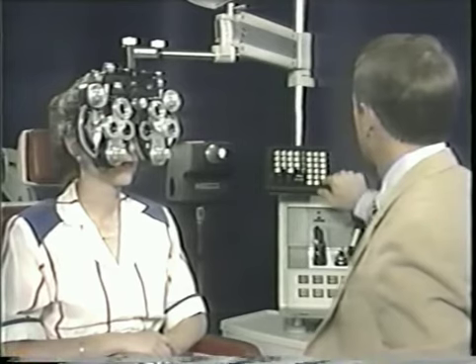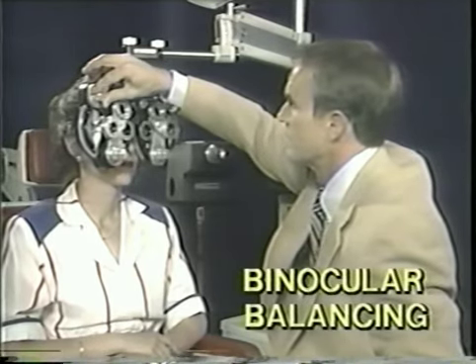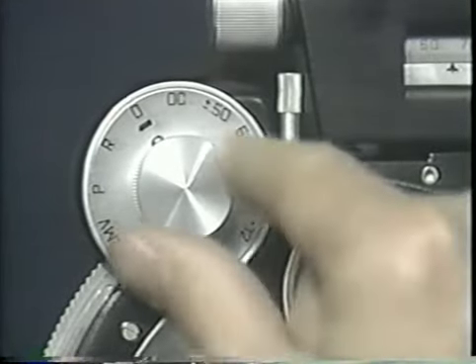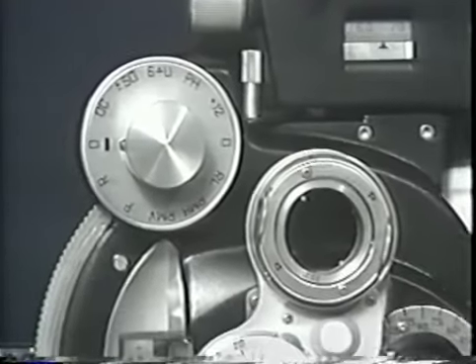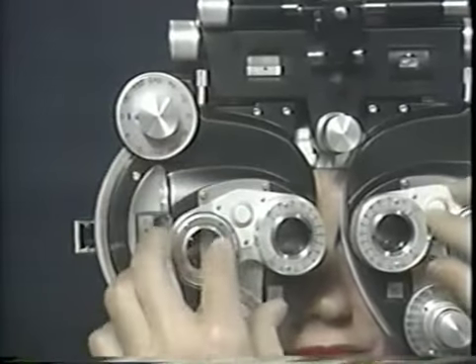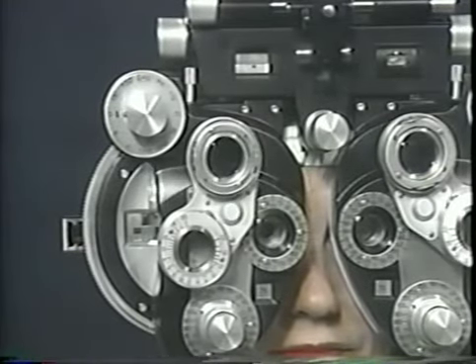Once each eye is refracted, and assuming corrected visual acuity is essentially the same in the two eyes, many refractionists perform binocular balancing. This is to be sure that the level of accommodation is balanced between the two eyes, which may not have been the case during the monocular refractions. One method of binocular balancing uses the 6-prism diopter base-up prism before the right eye to dissociate the two eyes. Some practitioners feel that this is too much prism and prefer to use 2-prism diopters of vertical prism before each eye for a total of 4-prism diopters of vertical separation.